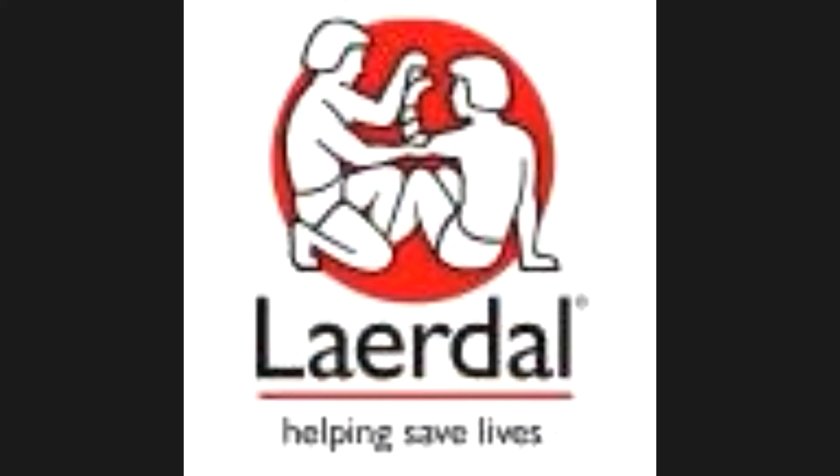And I'll see if I can link our resource page for everyone in the chat in case you want to keep it for later. Again, as Shane mentioned, we have a really nice few episodes on scenario design for Leap, as well as the theme editor and SimPad. So if that's interesting for you, I will put those resources in the chat for you.